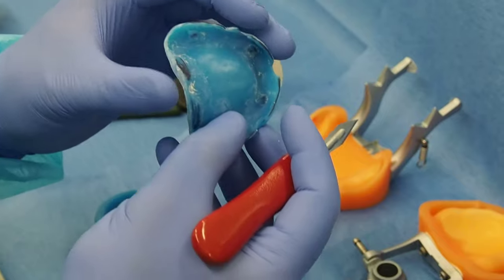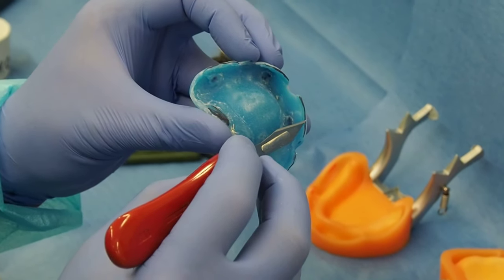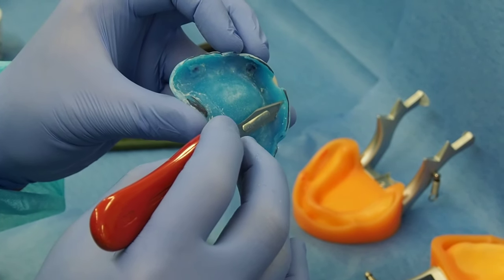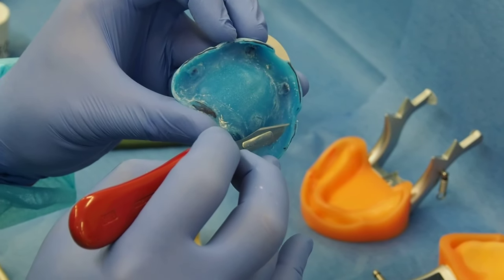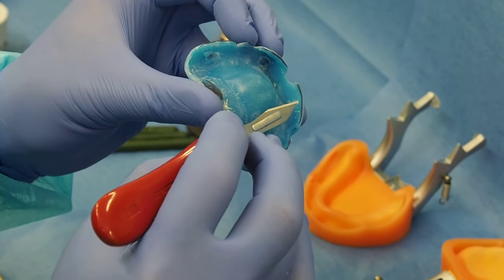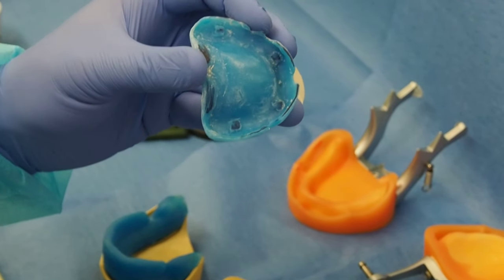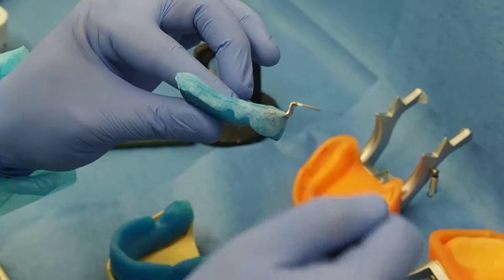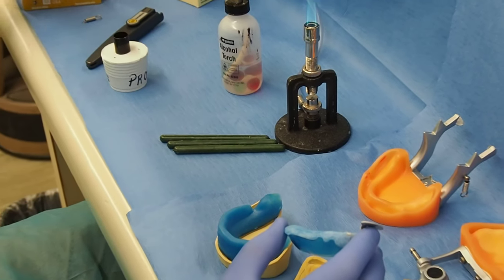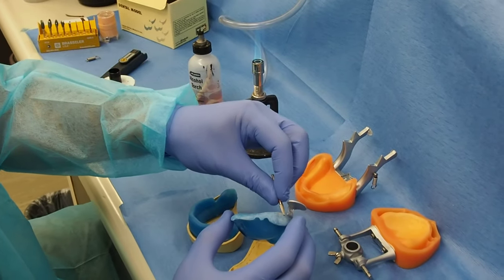As you look at this on the inside, you might be able to see where the wax relief was, and then a little step right there and then the limit of it. So this is the characteristics we need to have. Also, what I did is I went with an acrylic burr and kind of ground that oxygen inhibition layer.